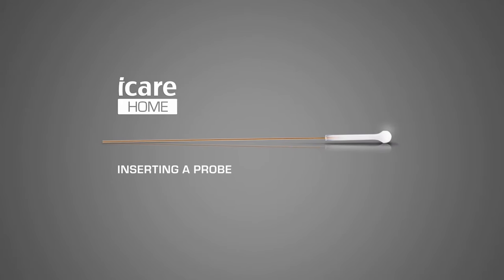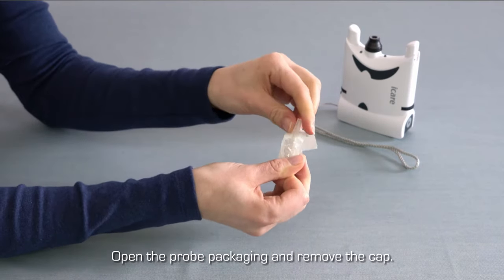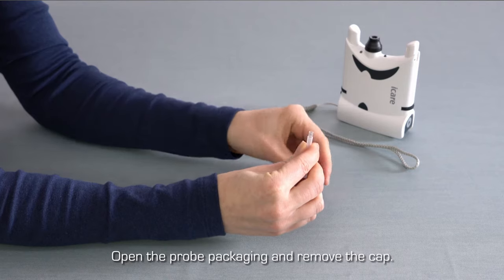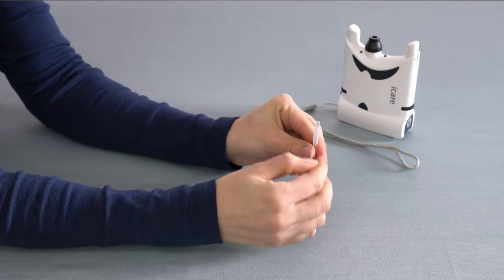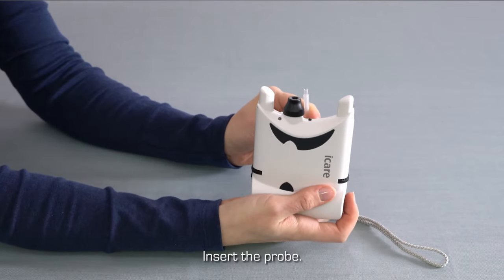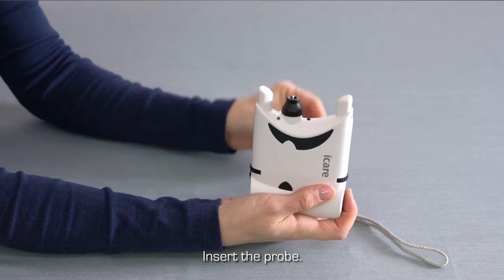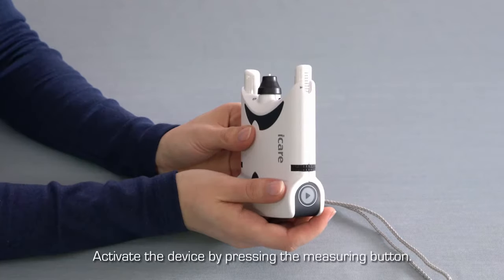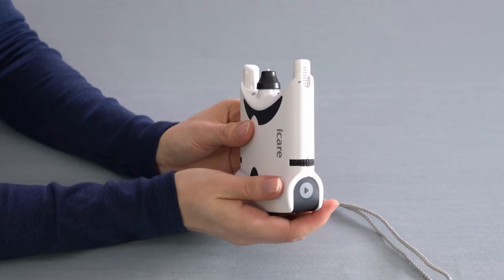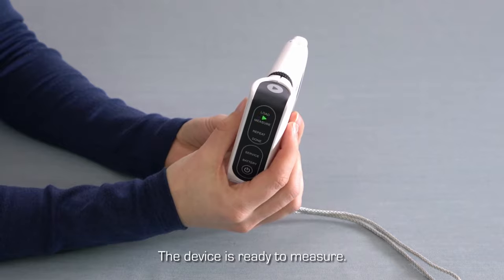Inserting a measurement probe. Carefully tear the packaging off the sterile probe container. Twist and pull off the cap from the container. Hold your tonometer so that the probe base is pointing up, and drop the probe from the container into the probe base. Keeping the tonometer in the same position, press the measure button to activate the device. While the tonometer is activated, the probe is always held in its base. Your eye care home tonometer is now ready for use.